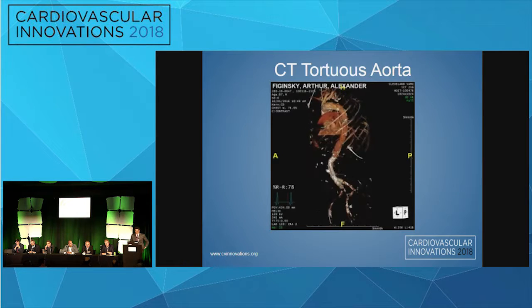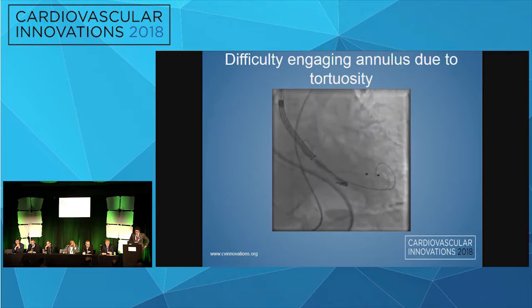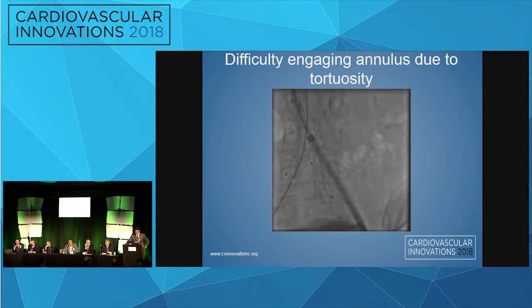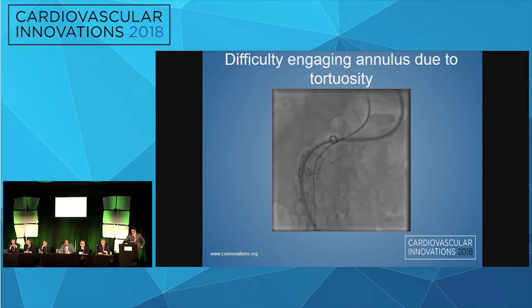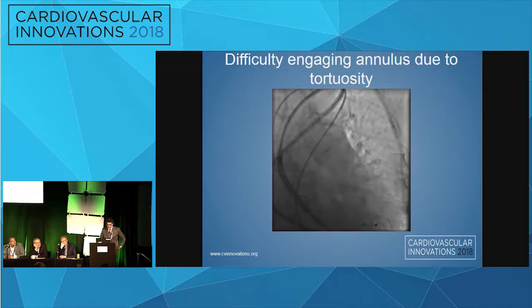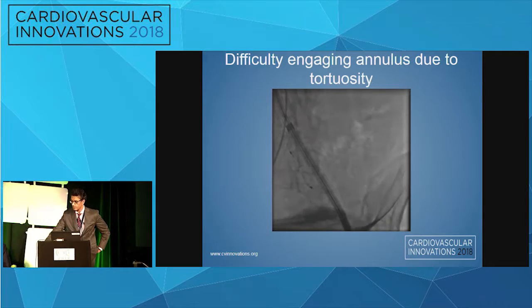Actually, given the complication I'm going to talk about, we'll say maybe it was not a good idea to do a subclavian. But the choice was CoreValve. This is just a run of the fluoroscopy for you to appreciate the degree of tortuosity. And that's an Evolut. It's a resheathable Evolut, not the Pro, but Evolut R.